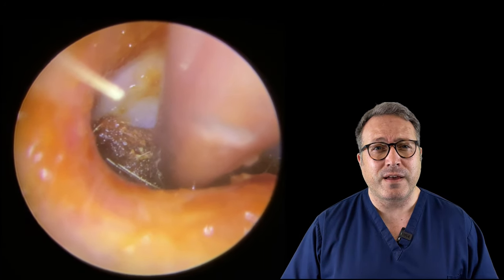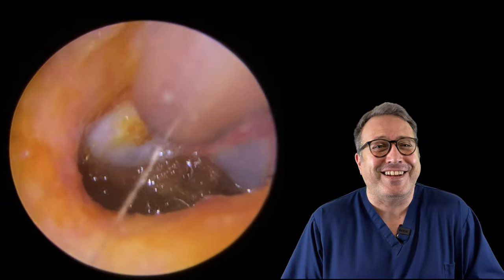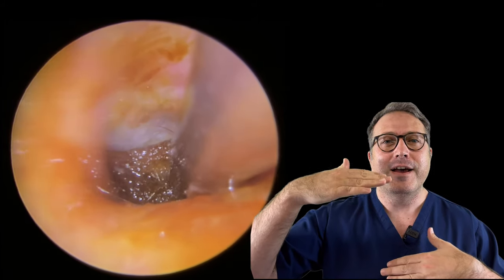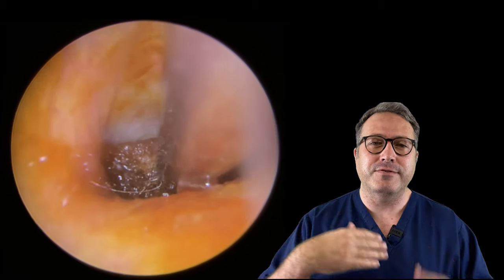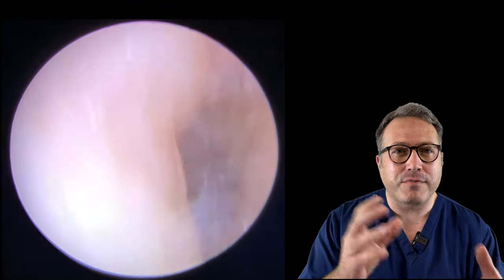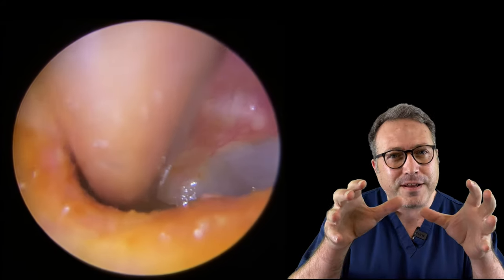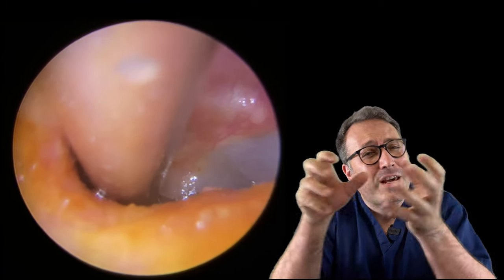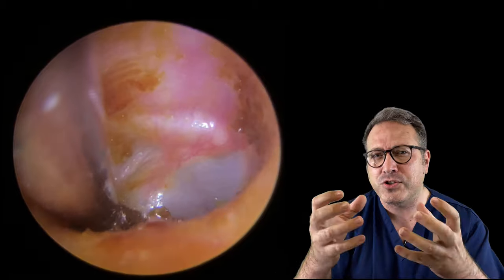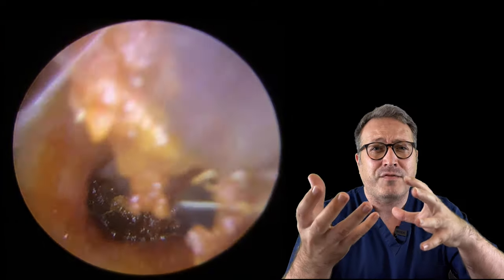Here we are - it's just starting to come away. We are working on the lighting, guys - remember I'm an audiologist, not a video editor; I'm trying my best to get the lighting right. It is a whole new ball game for me. It did appear as though I somehow had a very tanned face and body, or like somebody had superimposed my head on someone else's body. Anyway, here it comes - you can see it's just managed to come out. We just got the top section flicked away from the eardrum, so now we're going to get this last bit very, very gently.